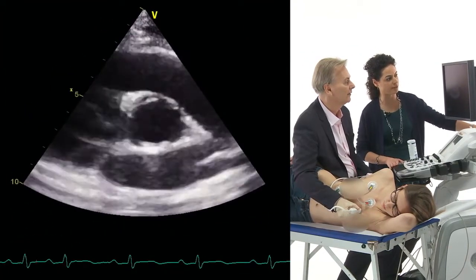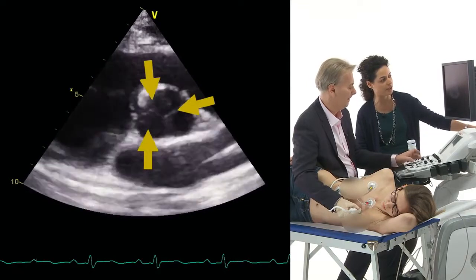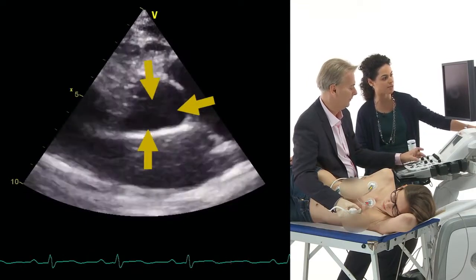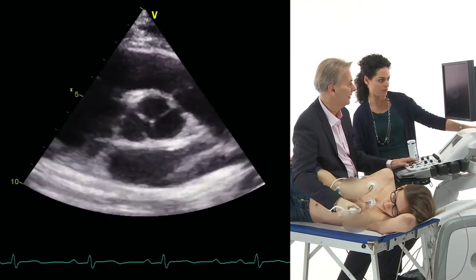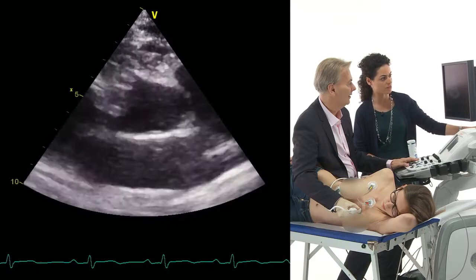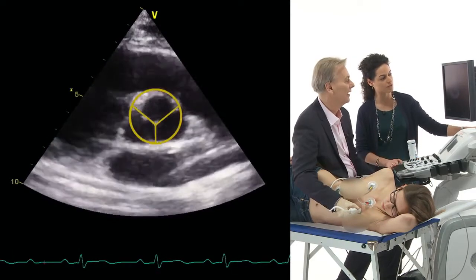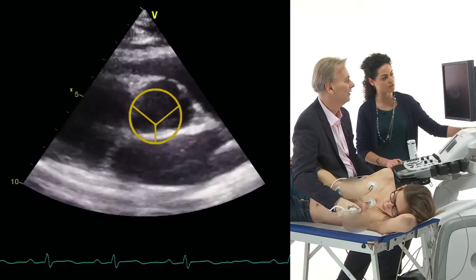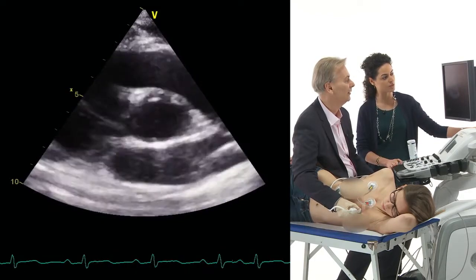This is great. We actually can see the three cusps opening and a really nice tricuspid aortic valve. Yes, you see the three cusps. And we usually say they look like the Mercedes star. This is how we check whether or not the valve is really imaged the way it should be.